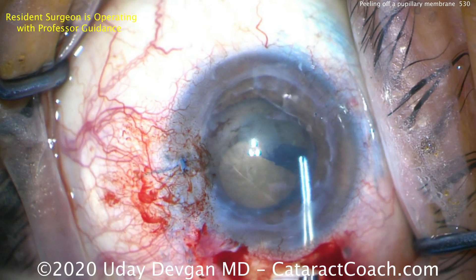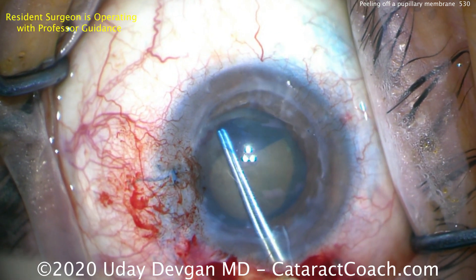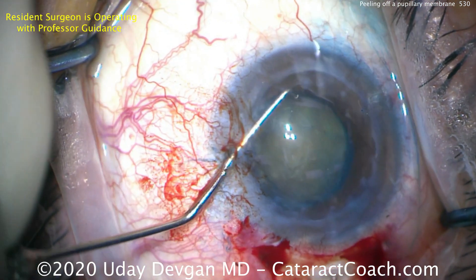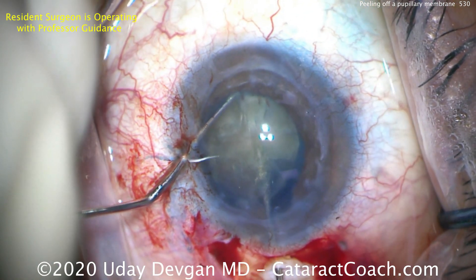Doing the capsulorhexis — you can see the trypan blue dye did a great job of staining the lens capsule. We don't want to make a baby-sized capsulorhexis, but we also don't want one that's too large; we want about a five-millimeter opening. Now putting the chopper in and a cannula — we're going to do a phaco chop before putting the phaco probe in.